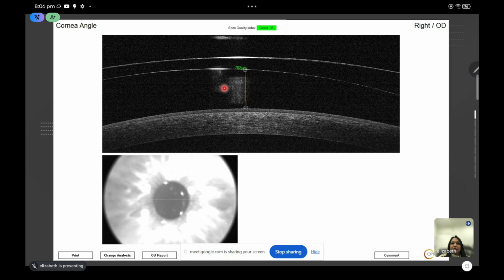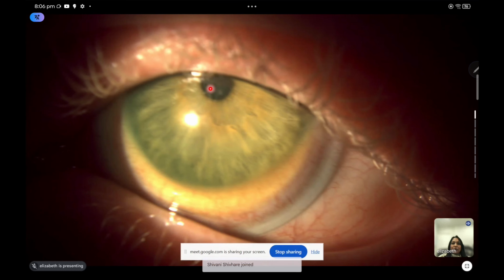This is also the reason why we had a minus 13.5 diopter prescription, because we had such a thick tear lens. And when we looked at it with the slit lamp, you can see this lens just doesn't look very good at all. We've got very tight edges. We've got lots of limbal clearance, and we can see that by the conjunctiva having this very popped up appearance. All right, so even without the fluorescein, even if you just looked at this straight on, you can see this is not fitting well. And this was our best fit we could achieve with the scleral lens.